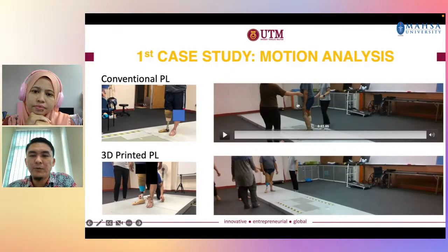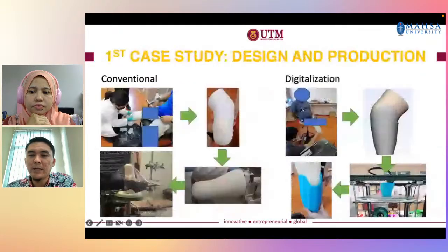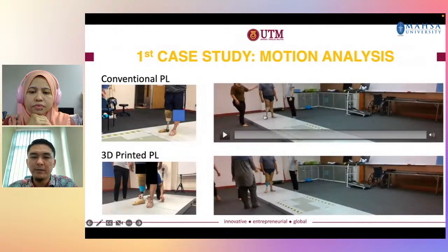Okay, so for this one, we have a force plate, which can detect the force when the patient steps on the plate. So again, I will repeat the video.